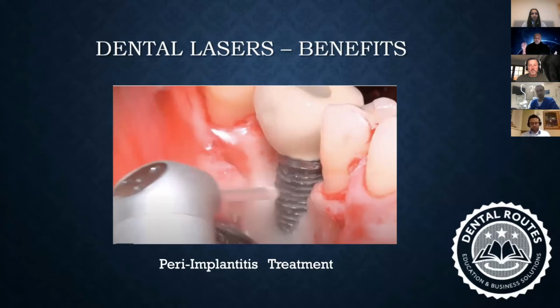So there is preferential absorption of these dental lasers by the bacteria only, which will lead to destruction of the bacteria. So you can completely sterilize a perio pocket or a peri-implantitis pocket just by using a dye and a laser with no need of any antibiotic whatsoever.